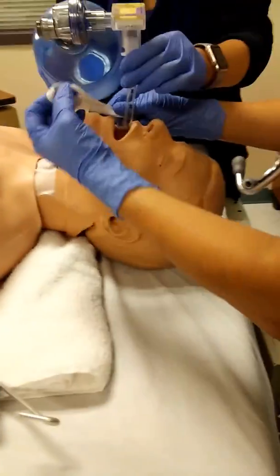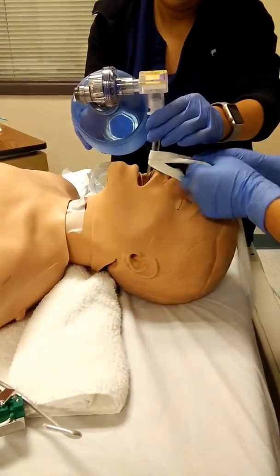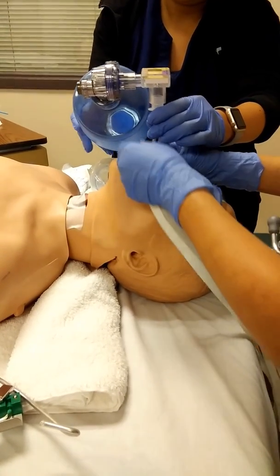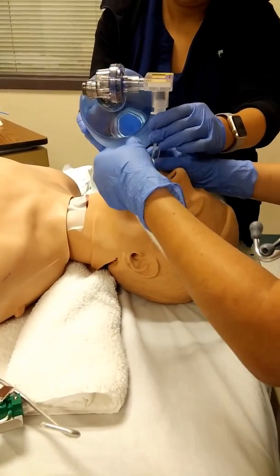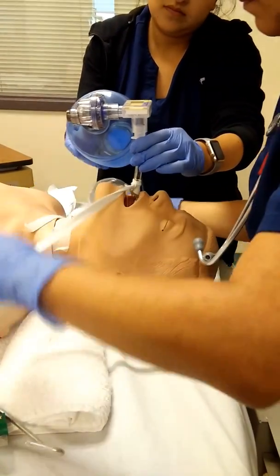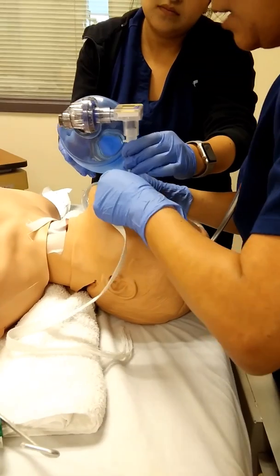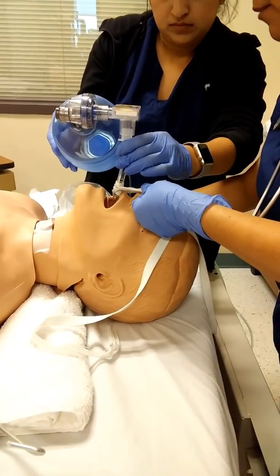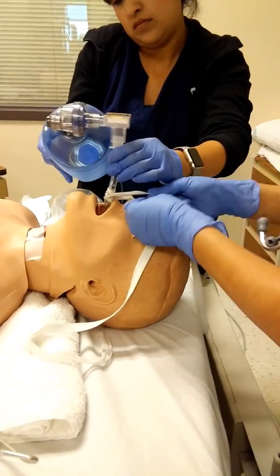Okay. And oxygen. Okay, so I'm just going to, and when securing the tube, we want to assure that we don't tie the balloon with it.